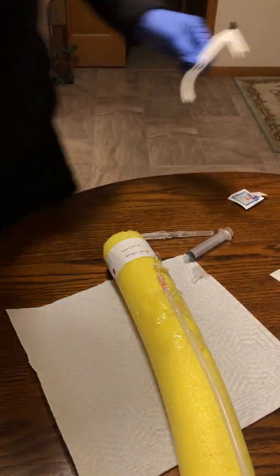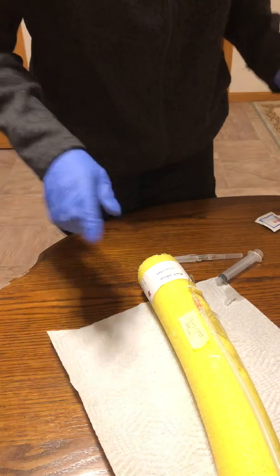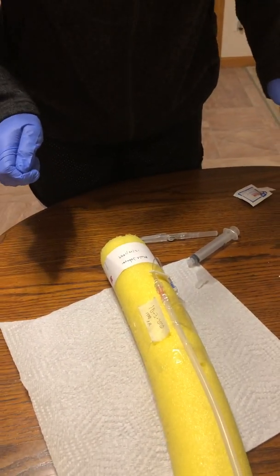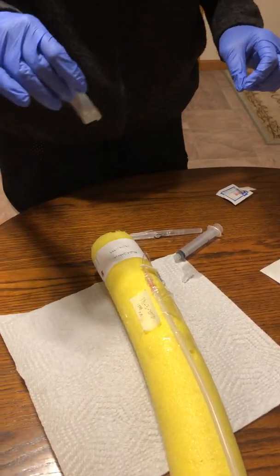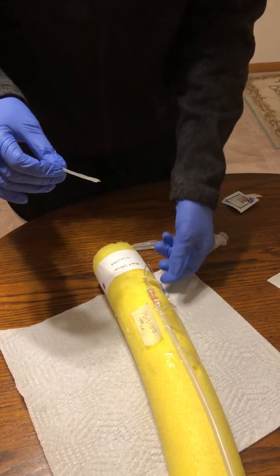Good. So now I'm going to put the date and the time and my initials on the bandage. Good. So next I want to tape, and the saline lock should be flushed at regular intervals per protocol when not in use.